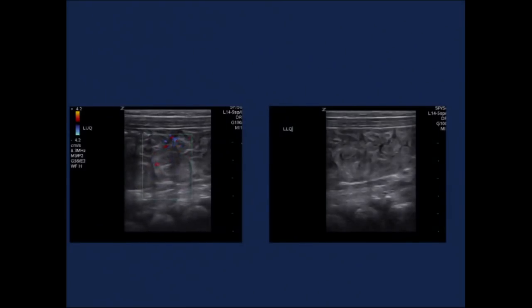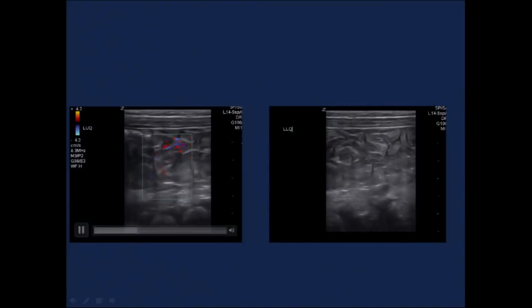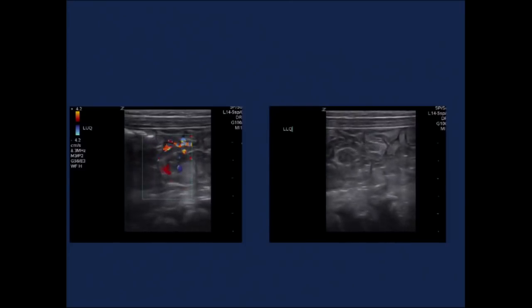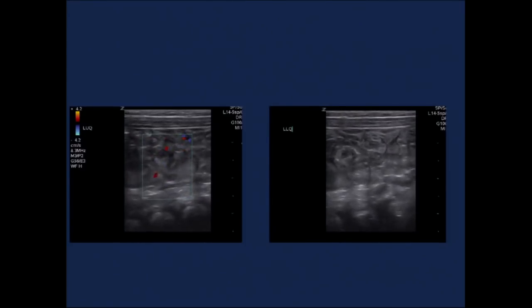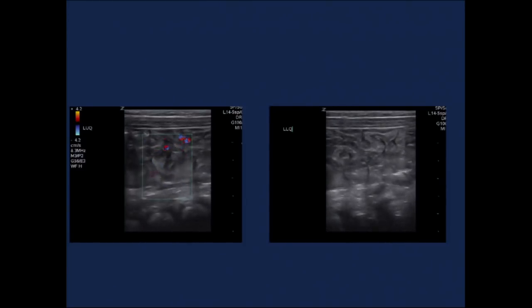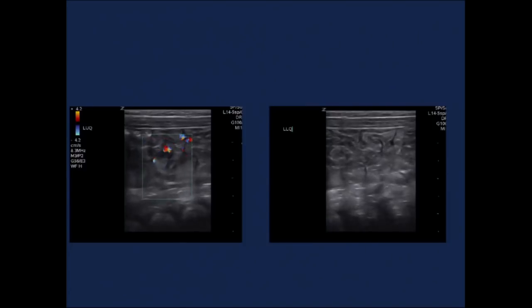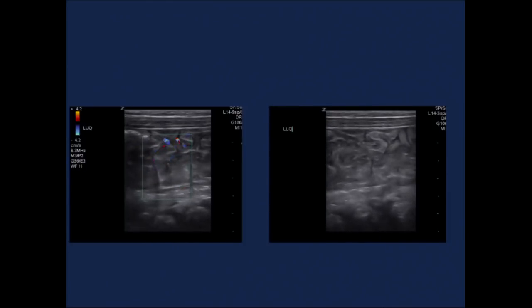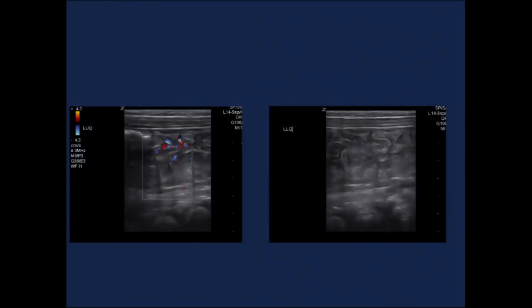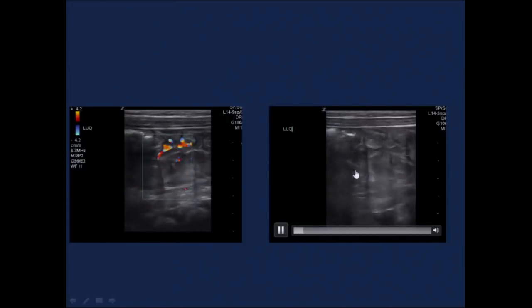So this ultrasound was done. The ultrasound is done exactly in the left upper quadrant, exactly the same area that was described as pneumatosis by X-ray. If I would like to select a study to teach the normal ultrasound, I will select this study. So this infant was started exactly the same day on feeding, and there was no other complication. If you don't have ultrasound, you might be hesitant to do that if you have a report from a radiologist of pneumatosis intestinalis, especially when you have an infant ventilated with some abdominal distension, so nonspecific markers. You have normal color Doppler, normal peristalsis, and normal echogenicity of the bowel. So that's a typical normal intestine.